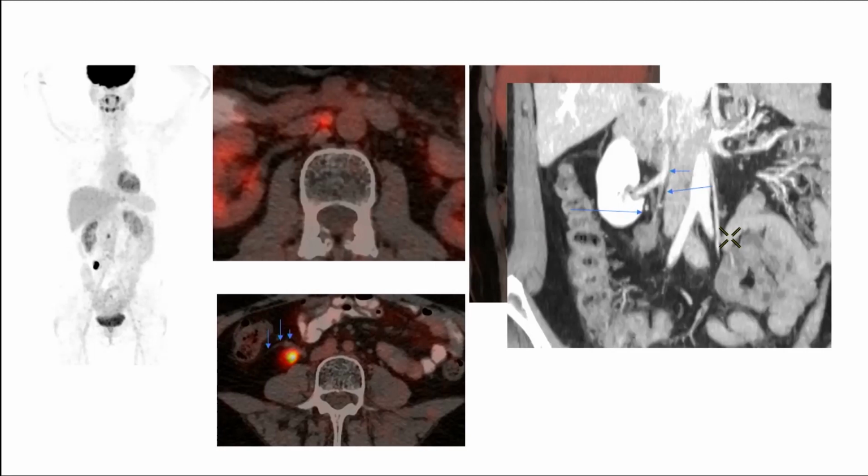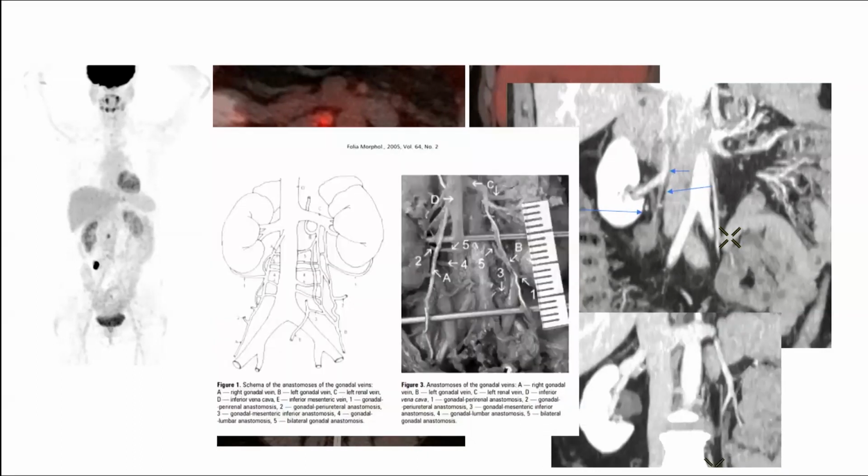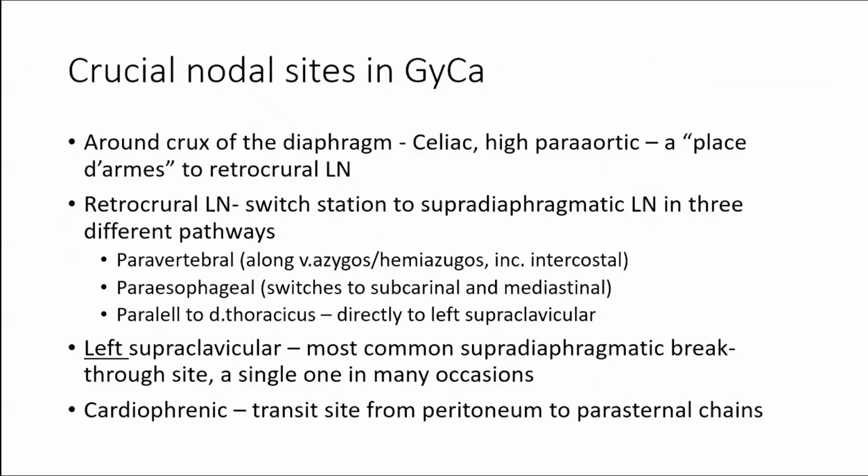So we have an open access around the ovarian vein to the perirenal space. And this is a simple explanation of how this lymph node got there. This is the normal vein that drains the upper part of the kidney. If you want to be aware of the lymphatic drainage, you should go through cadaveric studies, not the clinical studies. There you may find how it works.